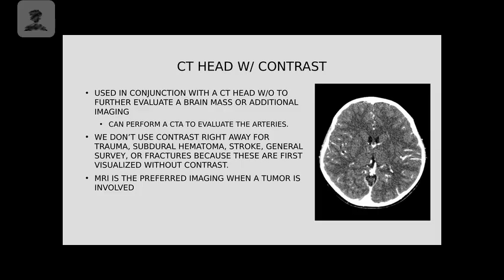But as far as emergency situations, if they're concerned about anything head related emergency wise, they're going to send them to us immediately. Especially strokes, they don't even typically stop in a room if they know for a fact that this patient is having a stroke. If they're showing all the signs out in the field, EMS is going to call in. They're going to give us their ETA, and as soon as they walk in the doors of the ER, they're going to cart them down to CT. And so you better be prepared to get them on the table and get their scan done, because a radiologist only has so much time in order to make a diagnosis.